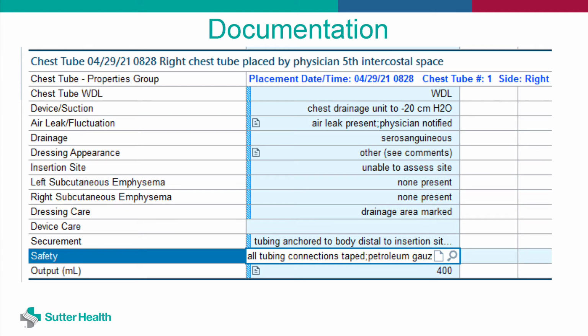Complete your documentation of the chest tube under the LDA flow sheet. For those working in the pediatric population, please see the pediatric chest tube and attached documents for further information.